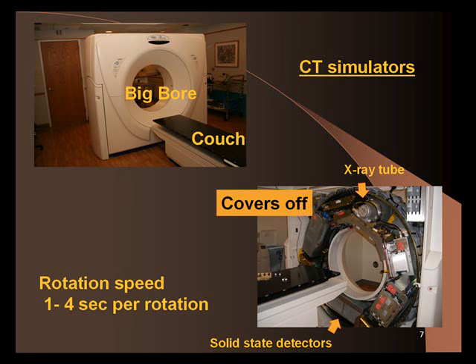So you're looking at the femoral heads, and the ischial tuberosity is over here somewhere, and the patient's skin is out here. So we have a large patient. Now the field of view in a regular diagnostic CT scanner cannot encompass the entire patient. It's just not big enough. What you're actually seeing is usually circular, something like this.